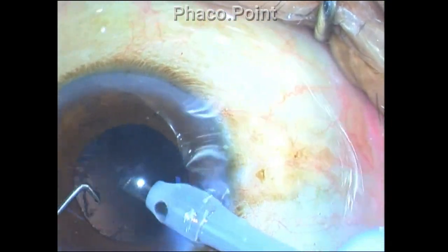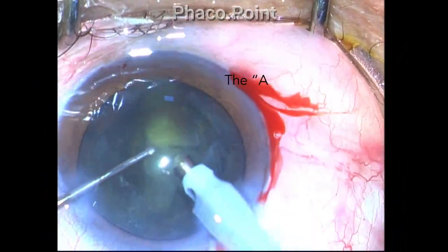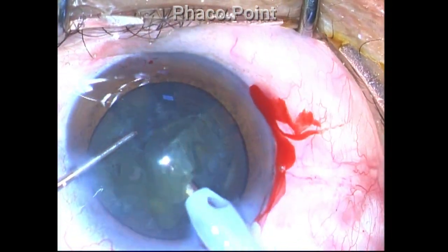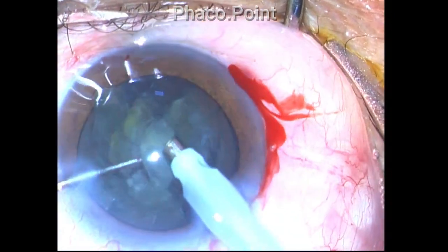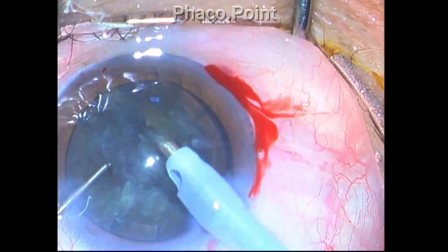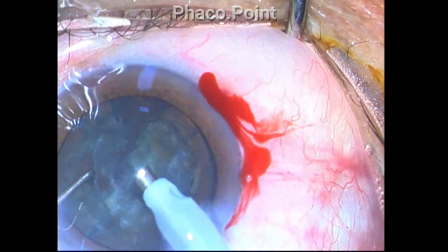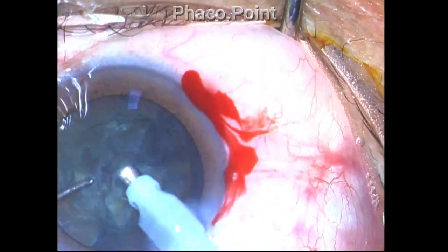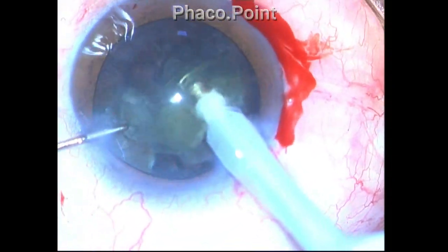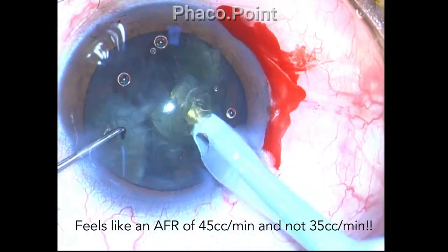Now let's take a look at a second clip and observe the followability of nuclear fragments. The vacuum setting in this case is exactly the same as the previous case; the nucleus grade is also exactly the same. However, you can see that the followability has improved a great deal. What you notice is that the surgeon is keeping the phaco tip steady in the center of the eye — he is not chasing after the pieces.